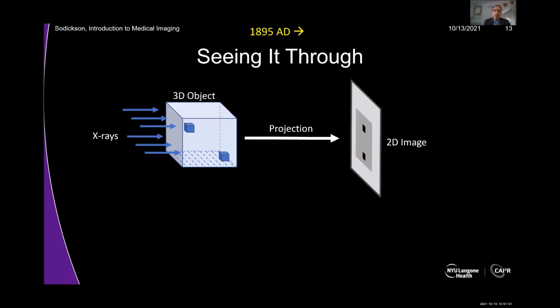Now, that's outer space. In order to have access to inner space, we first needed to be able to see behind the surface of things, see through the skin. And fortunately, in 1895, Wilhelm Conrad Röntgen discovered just the thing in the form of X-rays. And X-rays, of course, can blast their way right through previously opaque things, being attenuated progressively by any dense structures in their path.